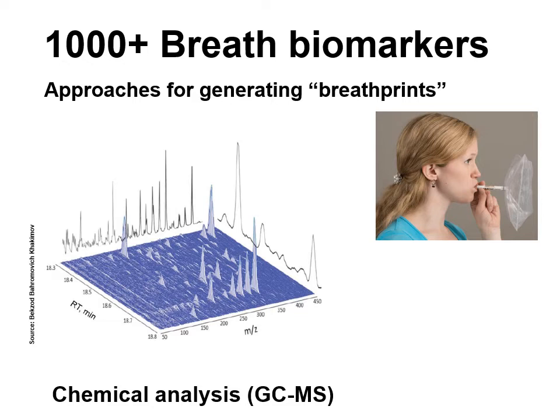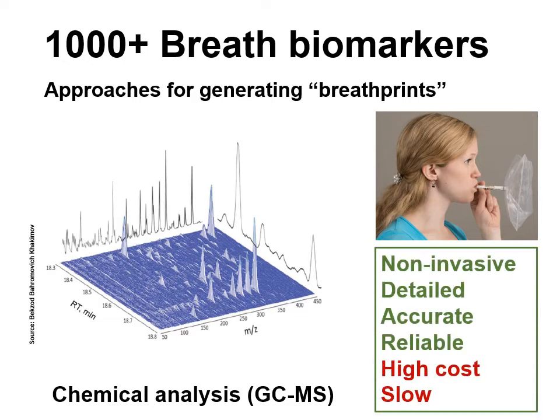Those machines are very expensive, which means that the work needs to be done offline. So by using this for breath analysis, we have an approach that's non-invasive, it's detailed, it's accurate, and it's reliable, but it's high cost and it's slow. You don't get the results at the same time that you've taken the test.